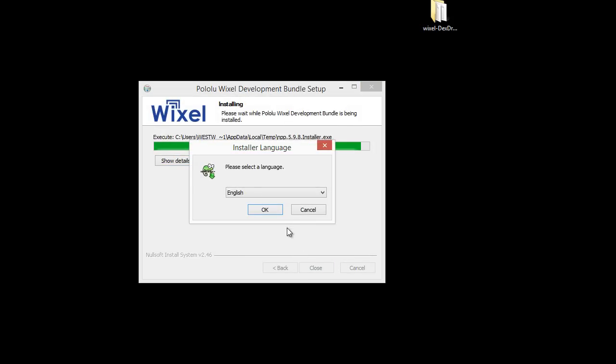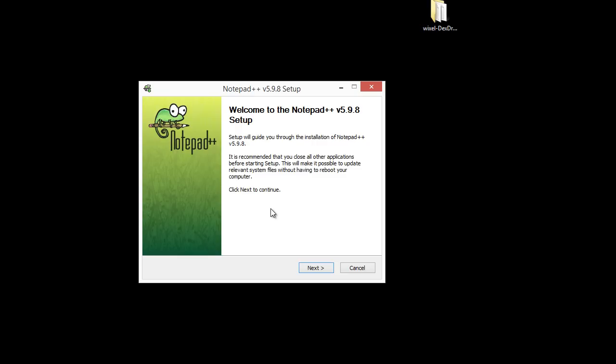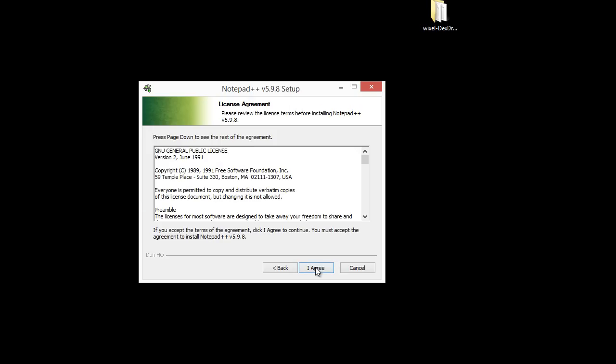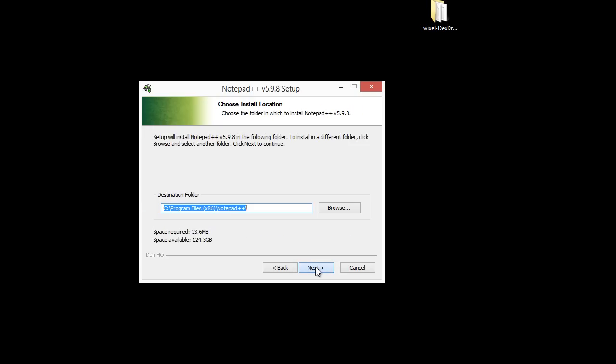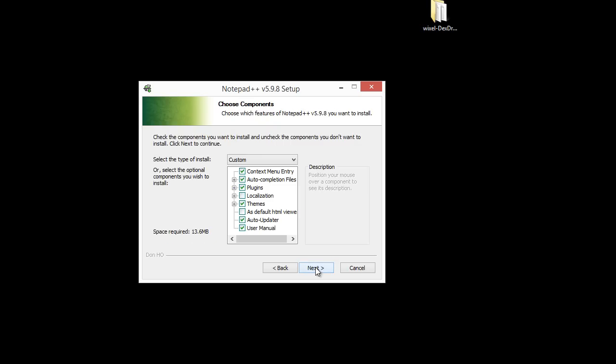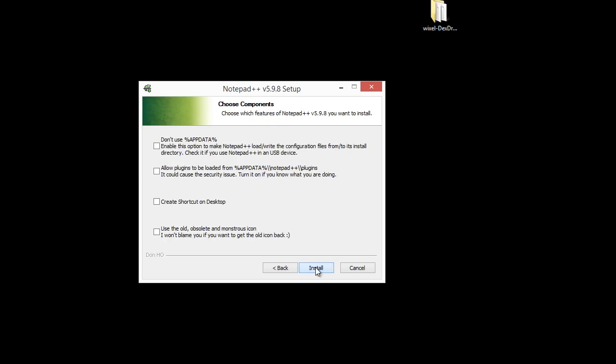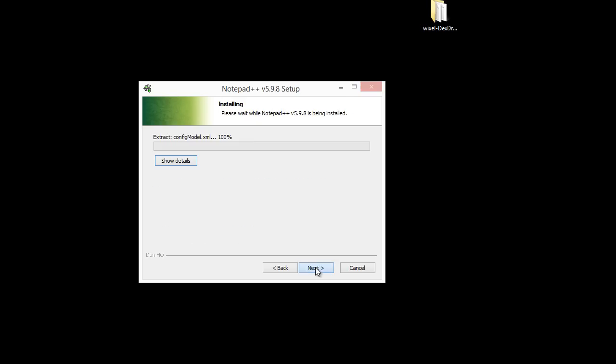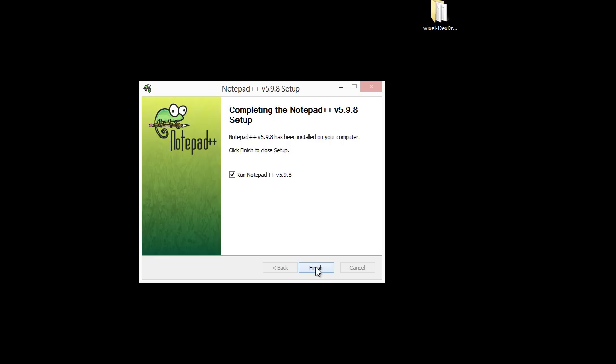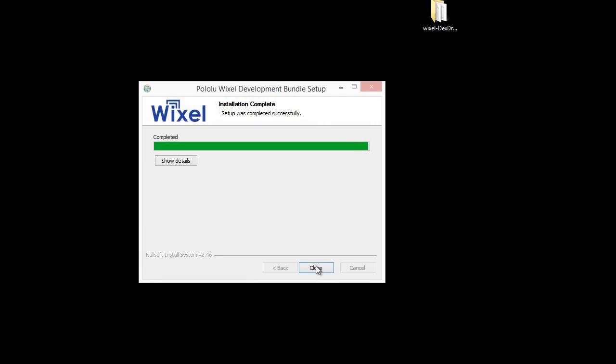And lastly it'll be installing the Notepad++, which we need to edit the Dextrip.c file that we downloaded from Stephen Black's GitHub. So that's done installing.